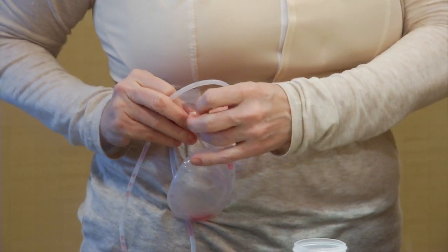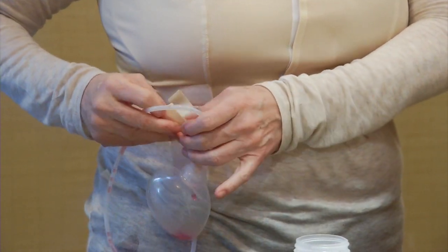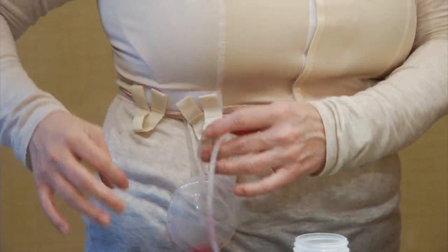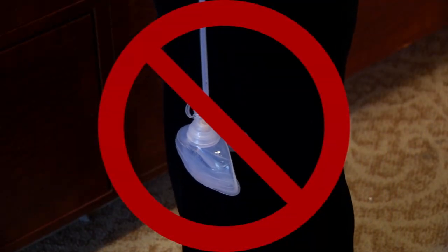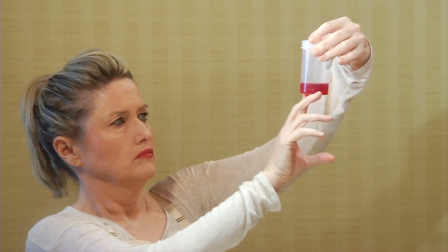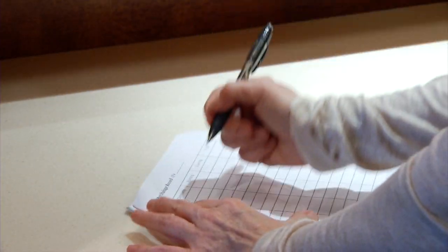If you're wearing a surgical bra, attach the Jackson Pratt using the Velcro straps. It's important that you never let the drain dangle. Check the amount and the color of the drainage in the measuring container and write both on your Jackson Pratt drainage record.